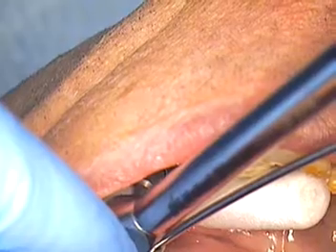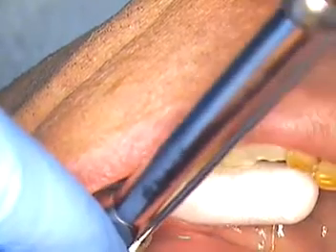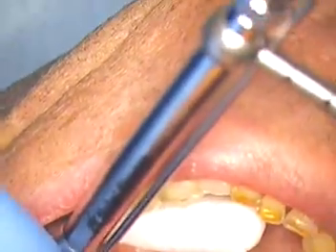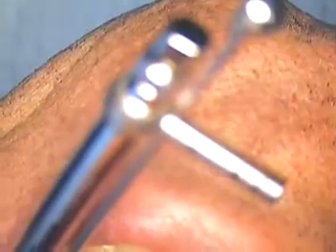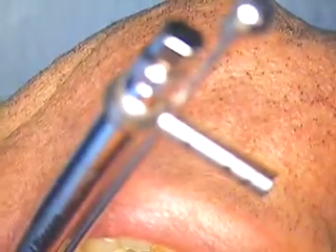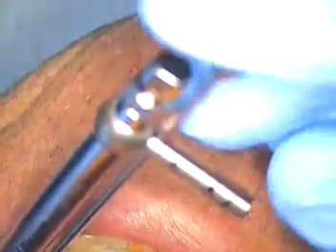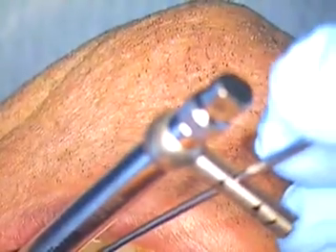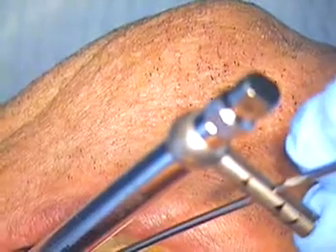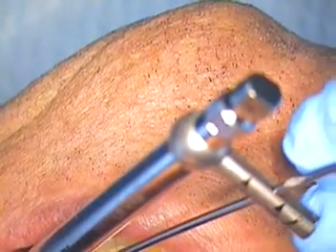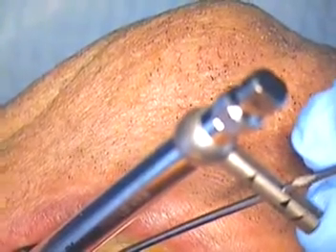And we're just short now, just to show you where we are on this. So here's the mark here. A little out of focus. Just to right about there. That's it. That's all you have to take it to.